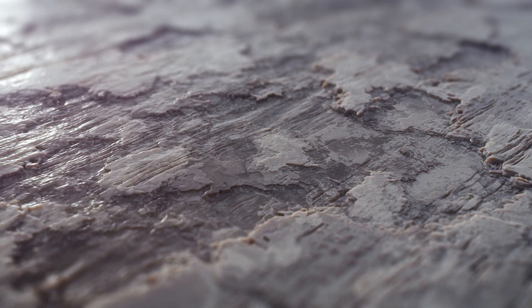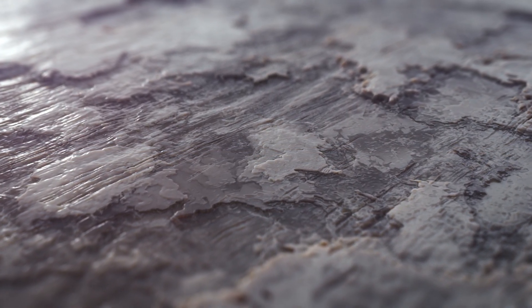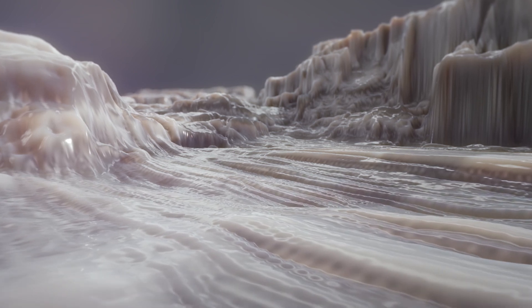Microtextured surfaces like these are known to produce inconsistent osteoblast reactions that can lead to failed interbody fusions, but by altering the nanosurface, shown here, desirable osteoblast function can be significantly enhanced.